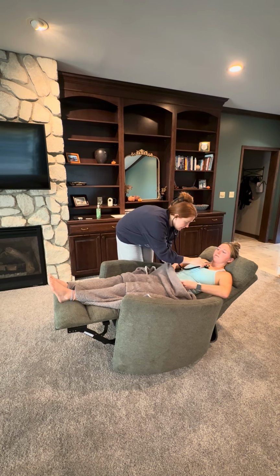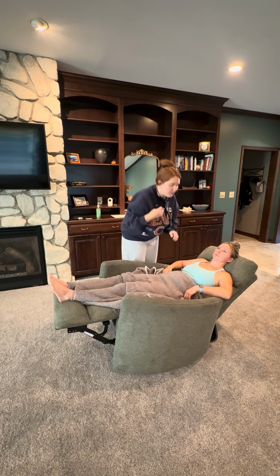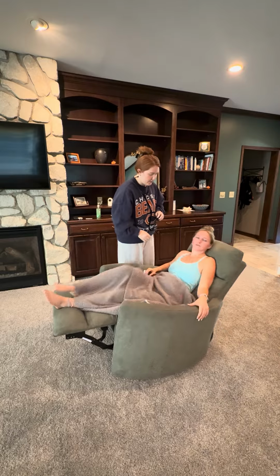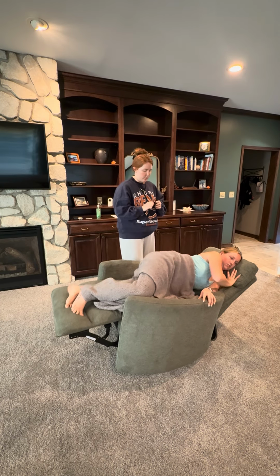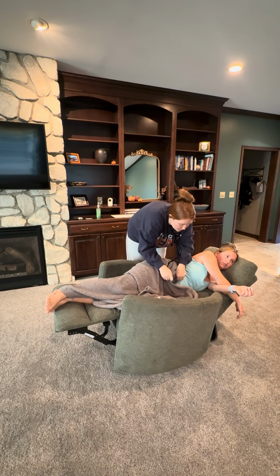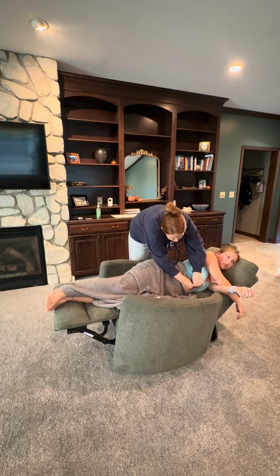Thank you. Then I'm going to have you turn on your left side, and I'm going to listen along the apex and the sternal border. So I'm going to pull your shirt up again. Starting at the apex.